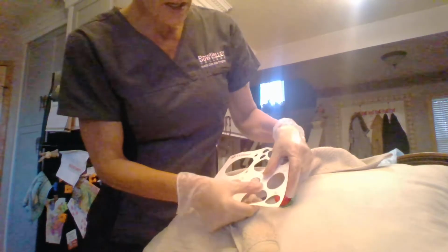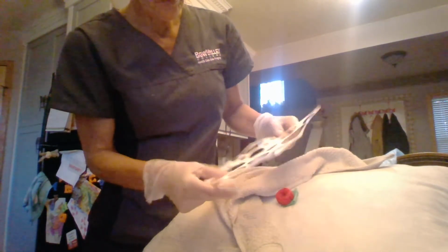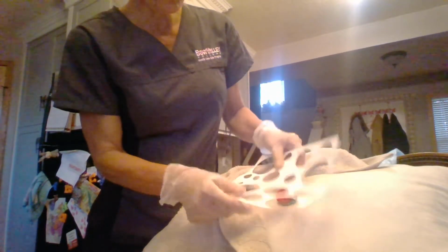Now, the chart, which everyone talks about, is that sometimes these systems don't come with markings to measure the size of the stoma. So we have a chart that we place around the stoma, which is now clean, and we measure the correct size with the chart.